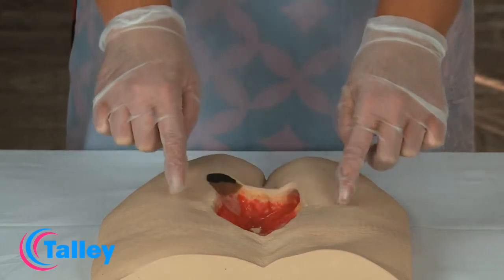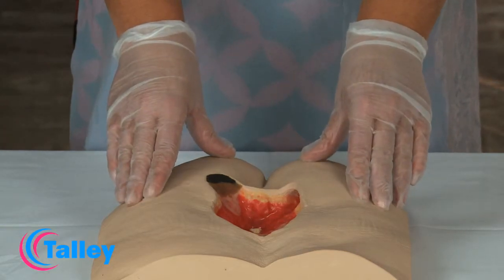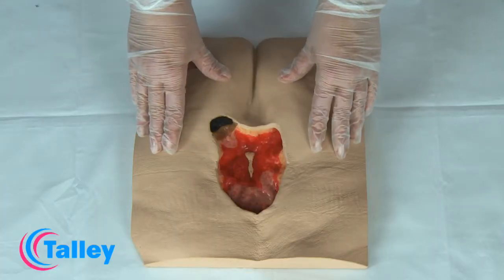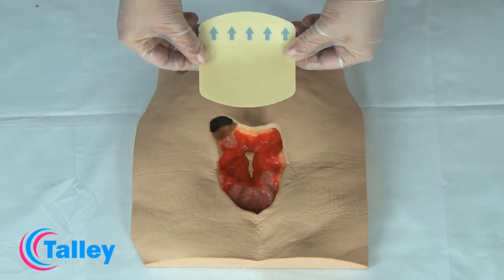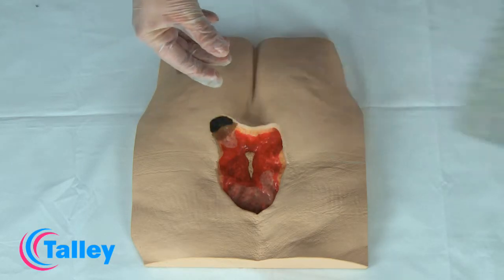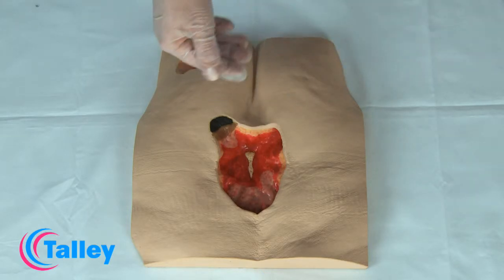Firstly, looking at the peri wound skin — if there is broken skin, red skin, or friable skin, it is recommended that some form of barrier protectant is applied. These may come in the form of a hydrocolloid dressing, a film dressing, a gel sheet, or a liquid barrier film.